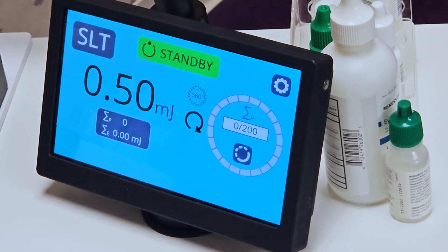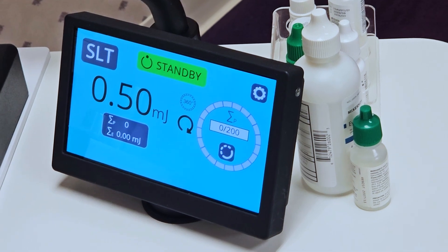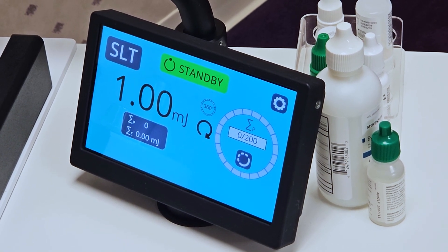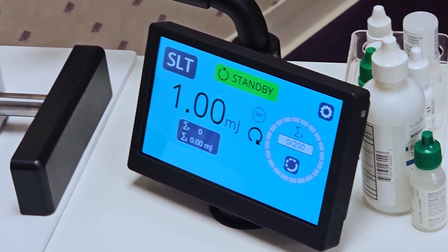I like this layout — I think it's very intuitive. Basically this is where I would enable my treatments. So let's say our standard one millijoule might be where you start. But let's say that I want to do a superior 180 and I want to do 50 spots.